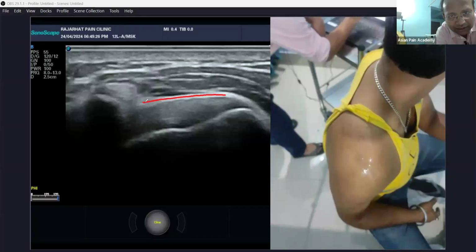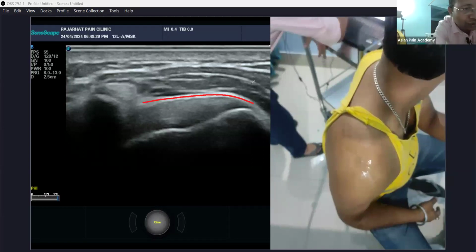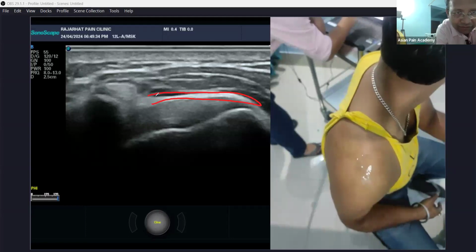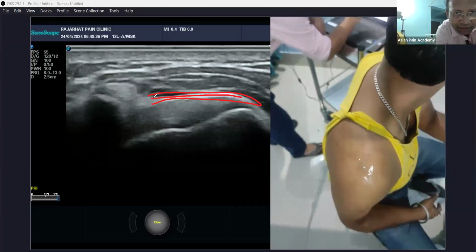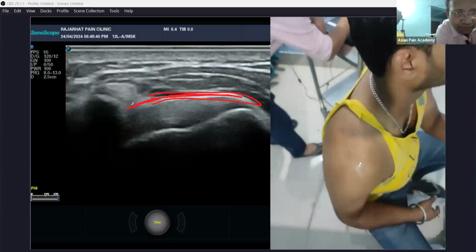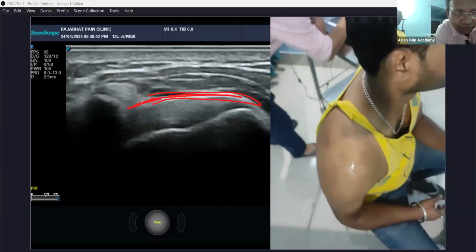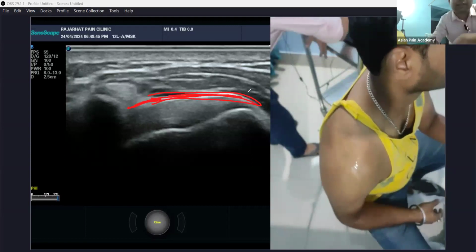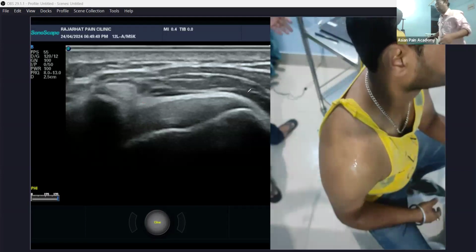This is nothing but the bursa. Between these two layers, first see the big white line, and just between the white line there is a black line. Our intervention should be in this black line, so that you inject in one part and the whole part is inflated. I will show the videos, of course.